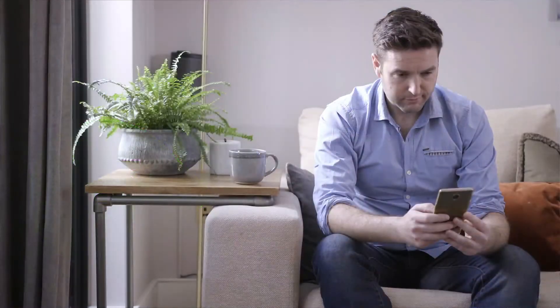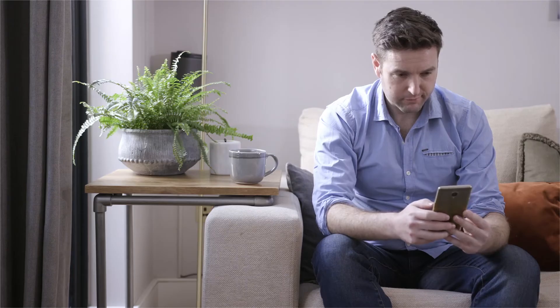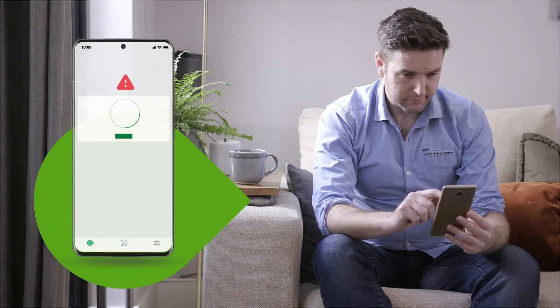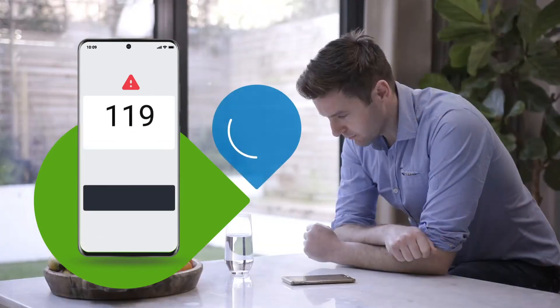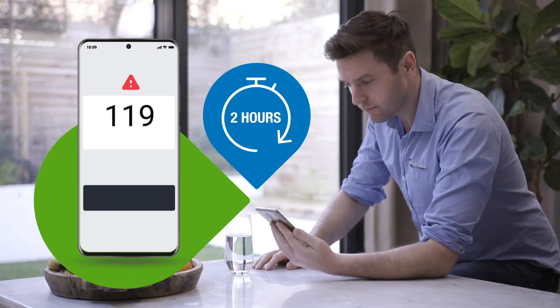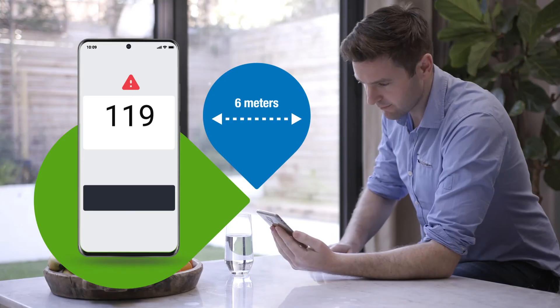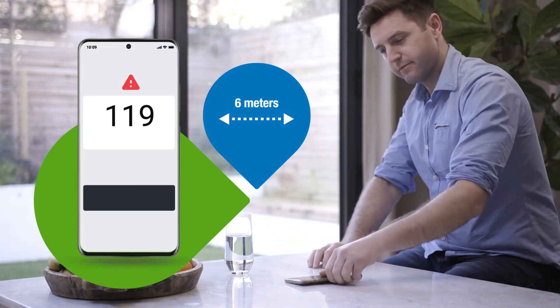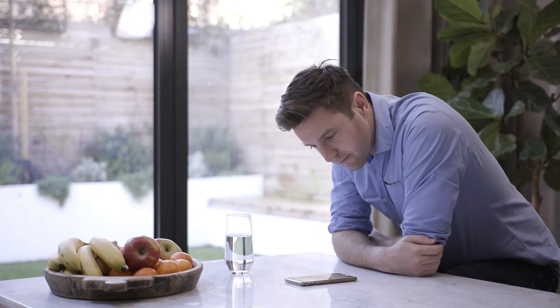Back on the app, confirm you have inserted your sensor and attached your transmitter. Wait for your transmitter to pair and start the sensor warm-up. The warm-up will take two hours to complete and you will not receive readings during this time. Keep your smartphone close to you, within six metres during warm-up. That's how straightforward it is to get started on Dexcom One.